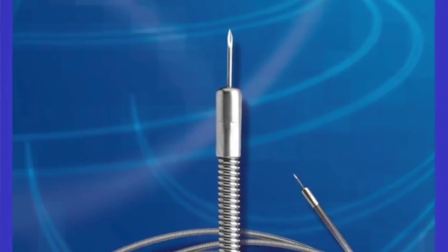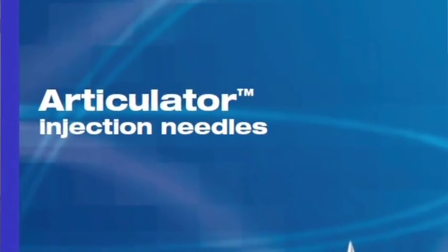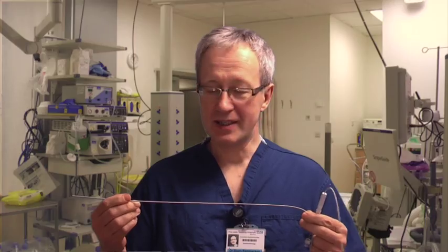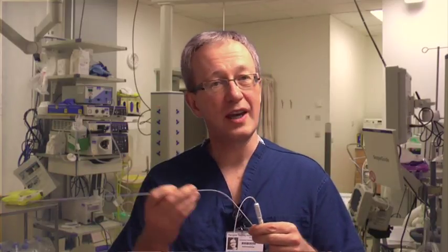I promptly moved on to this baby — the US Endoscopy Articulator needle, which I think is a beauty. It's a stainless steel sheet so it won't kink, a sharp needle on the other end, spring-loaded and lockable. I loved it and I've used it for many years, so this is now my champion needle.